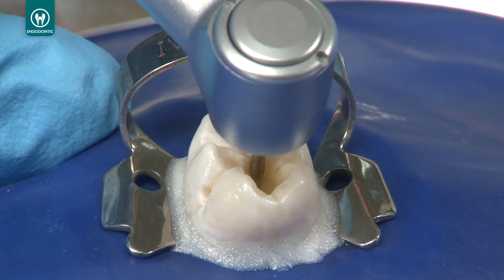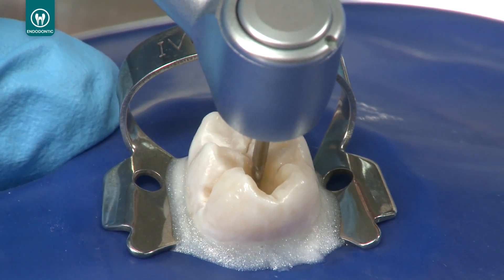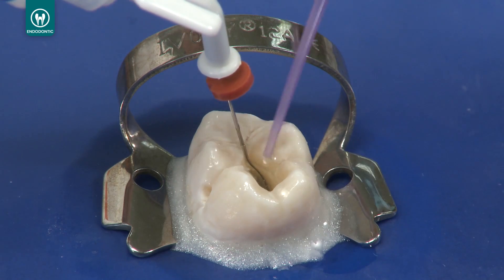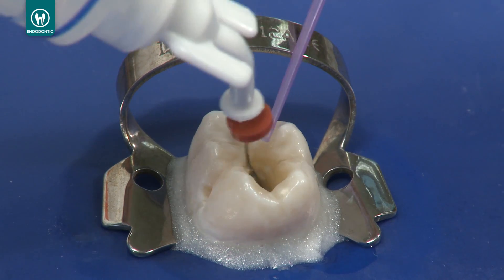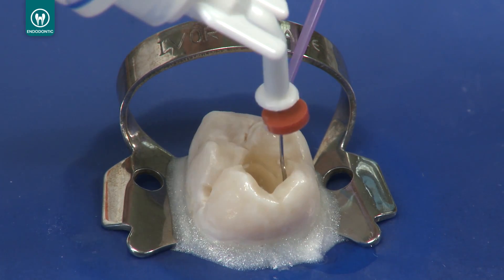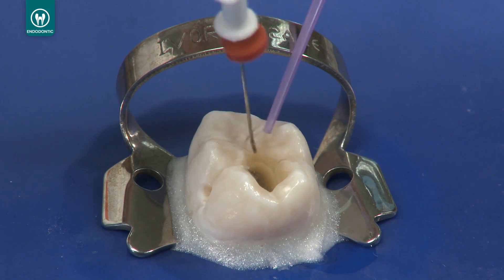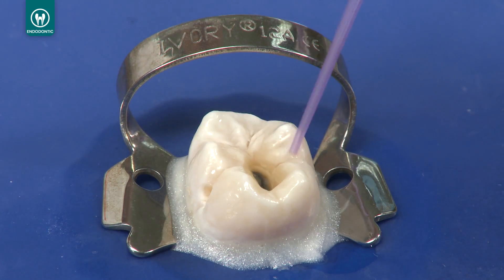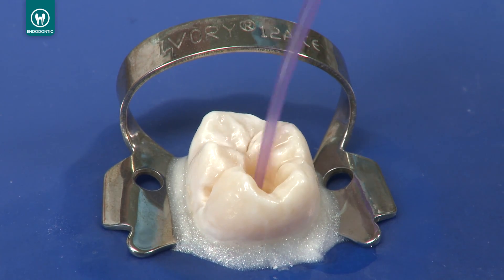Pre-flare the canal to partially remove canal contents and establish patency to your temporary working length. To ensure proper apex locator measurements, verify that the canal is not completely dry. Fill the canal with an electrolytic solution, like Chloracid or Chloracid V 3% sodium hypochlorite, to ensure a good conductive medium for a proper signal and readout. Suction the excess solution from the pulp chamber with a capillary tip, leaving only the canal wet.